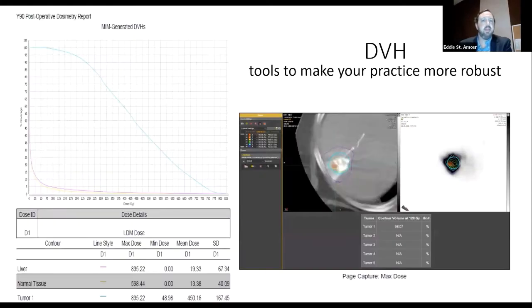And then in conjunction with the imaging, we have adopted tools that we feel add value to our service and could potentially alter a patient's treatment plan, as has been demonstrated in Asia, where they're using SBRT to touch up the edges. This dose volume histogram gives us a better understanding of how much dose was deposited in the tumor, gives us an idea how we might think the patient will do. And if you're in a practice like mine, it's important to know that it's also reimbursed.